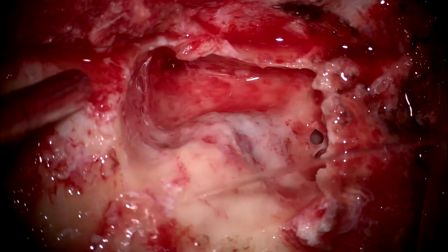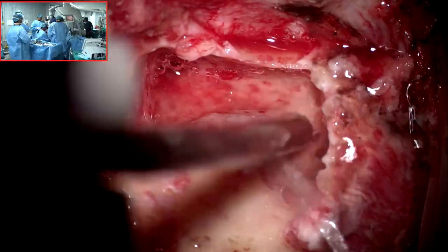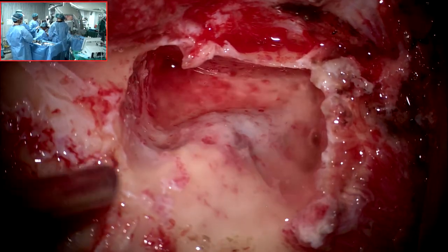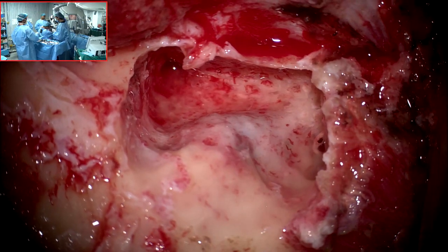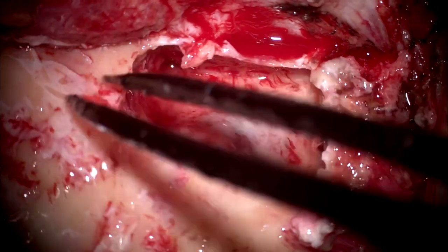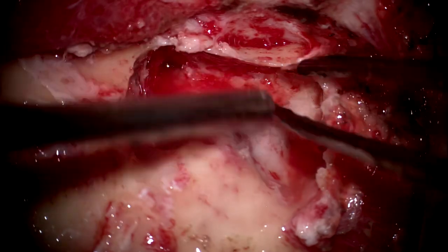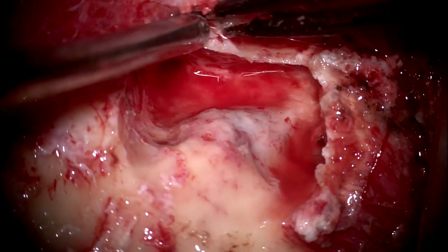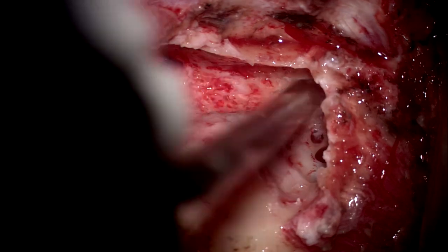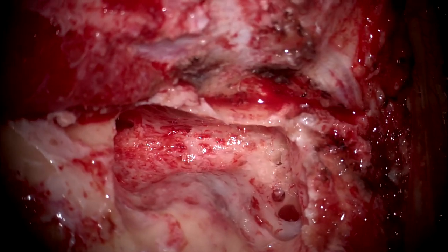So this was a great job done by this team, Dr. Hajra, Dr. Shijana and Dr. Ankit. They raised the entire flap. See this wide flap elevation. Where is the bipolar? Very nice job done. Now, for the translab, let us delineate our limits further.